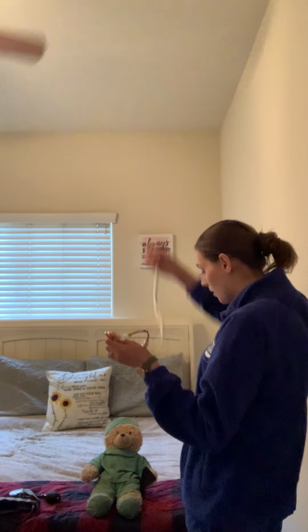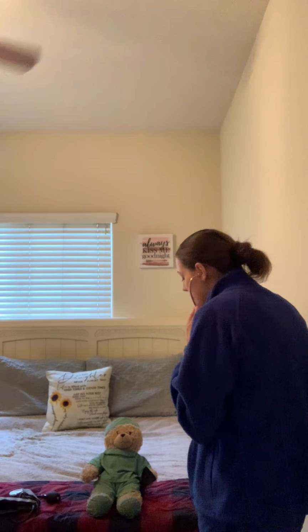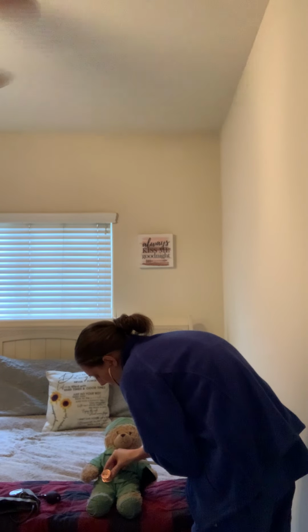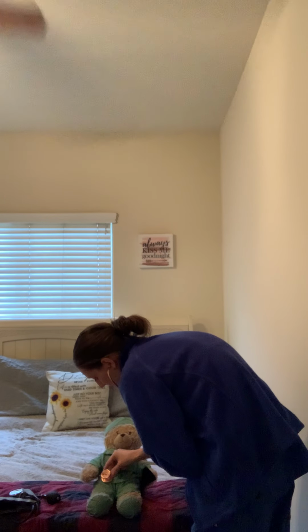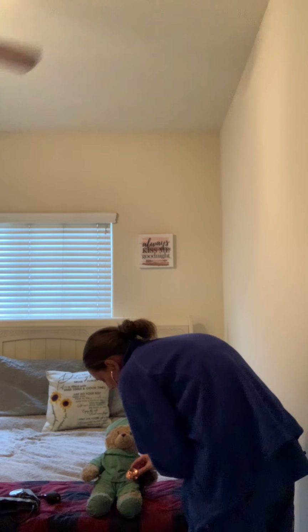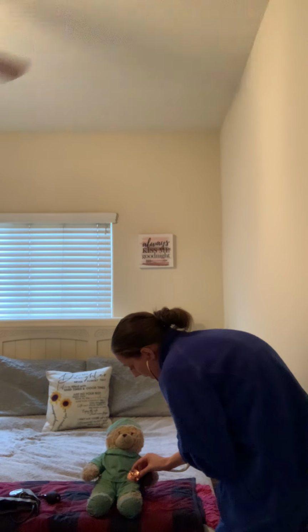And then I can auscultate in all 4 quadrants. I'm just going to start at the right lower with my diaphragm. I'm going to listen there. Go clockwise. So I've done that, and I've heard normal bowel sounds throughout.